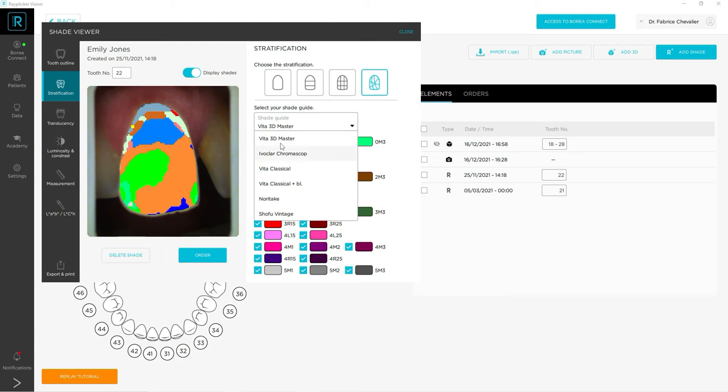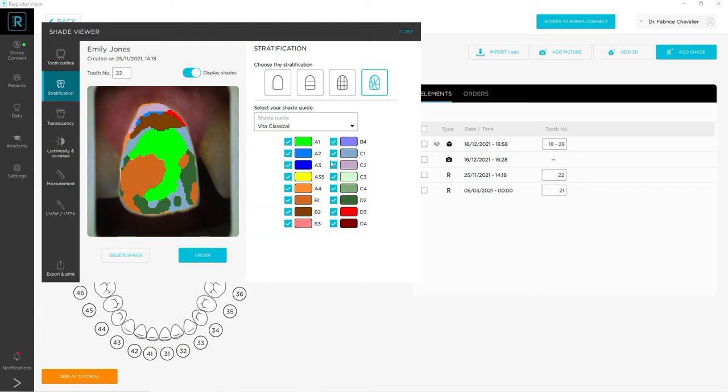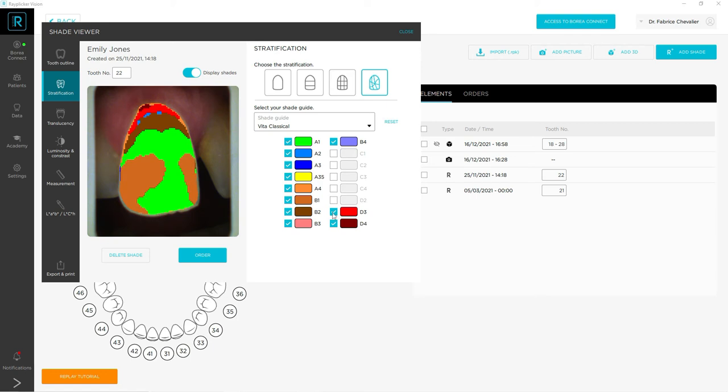And finally, you can select the shades you have for your composites. As you can see, when I uncheck the boxes, the mapping on the left will be automatically recalculating with the closest shades you have that remain selected. Once you have done that, you will have to use this new mapping to make your composites.